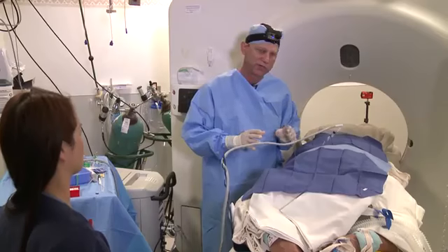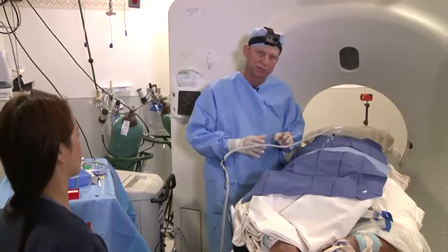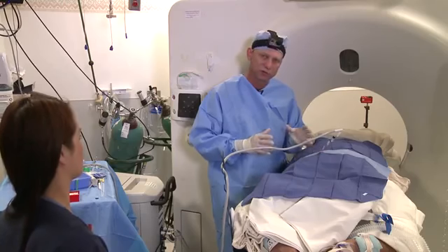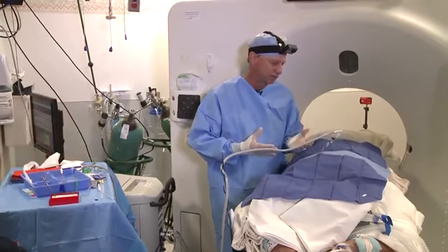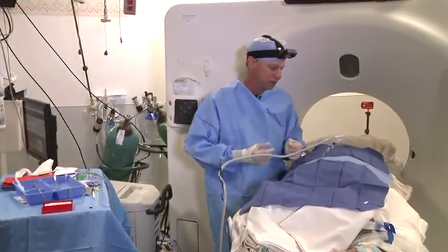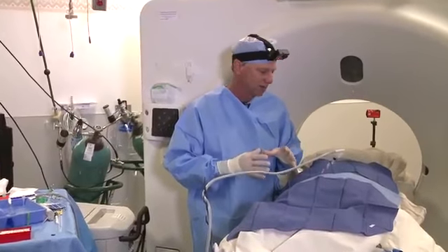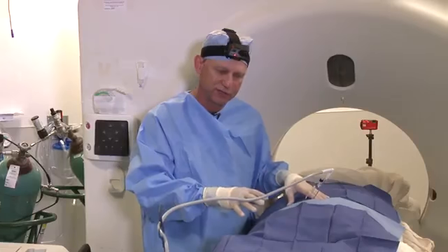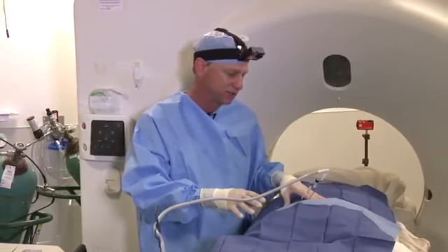Moreover, we're using general anesthesia. We don't use general anesthesia because it hurts, because freezing really doesn't hurt. And if you have patients that can't go under, you can do this with just conscious sedation. But GA is wonderful. Our anesthesiologists come over and help us with these guys. These are kind of long procedures. I think if he's laying here, he'd have a hard time laying still.